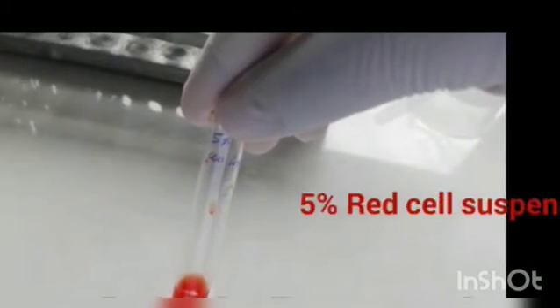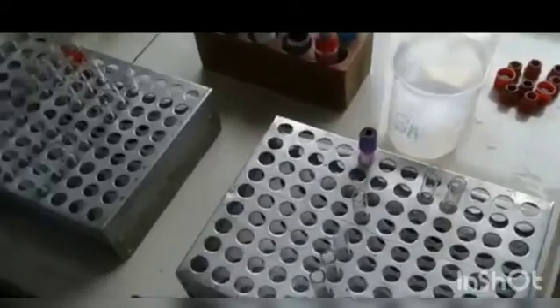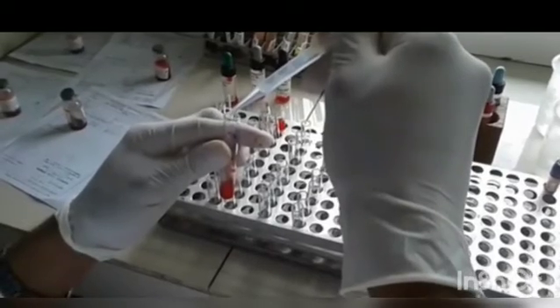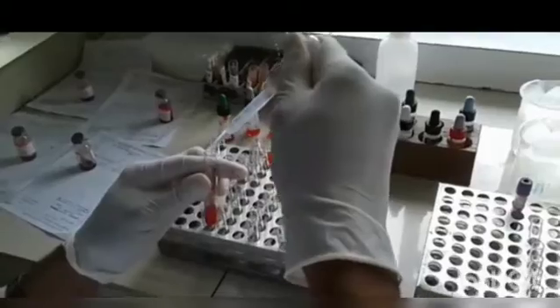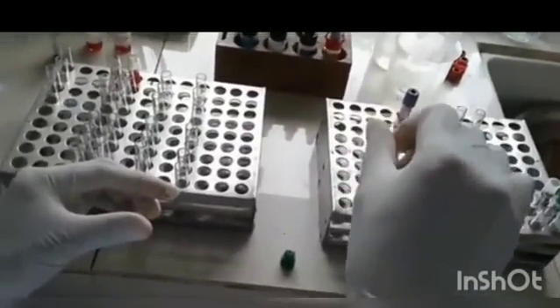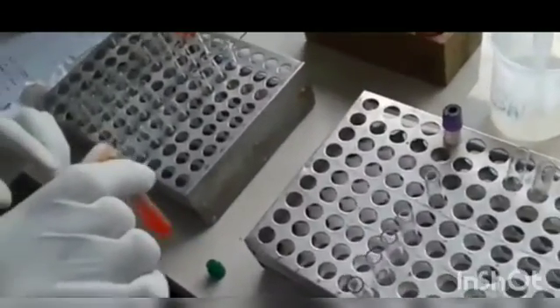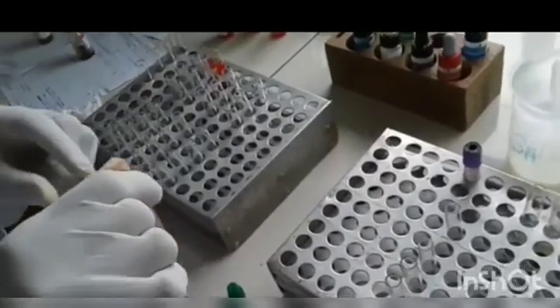So we have to make a 5% red cell suspension. For that, you take the red cells and then add 19 drops of normal saline. Keep in mind that the red cell suspension should be a red tomato color. So you mix properly, and then mix it by using a pasteur pipette.